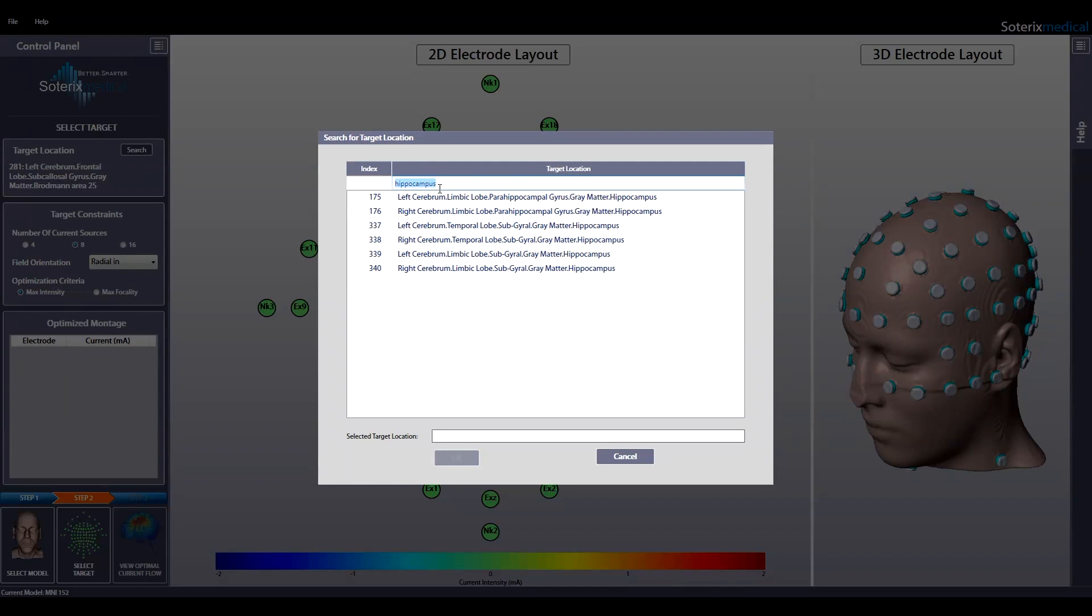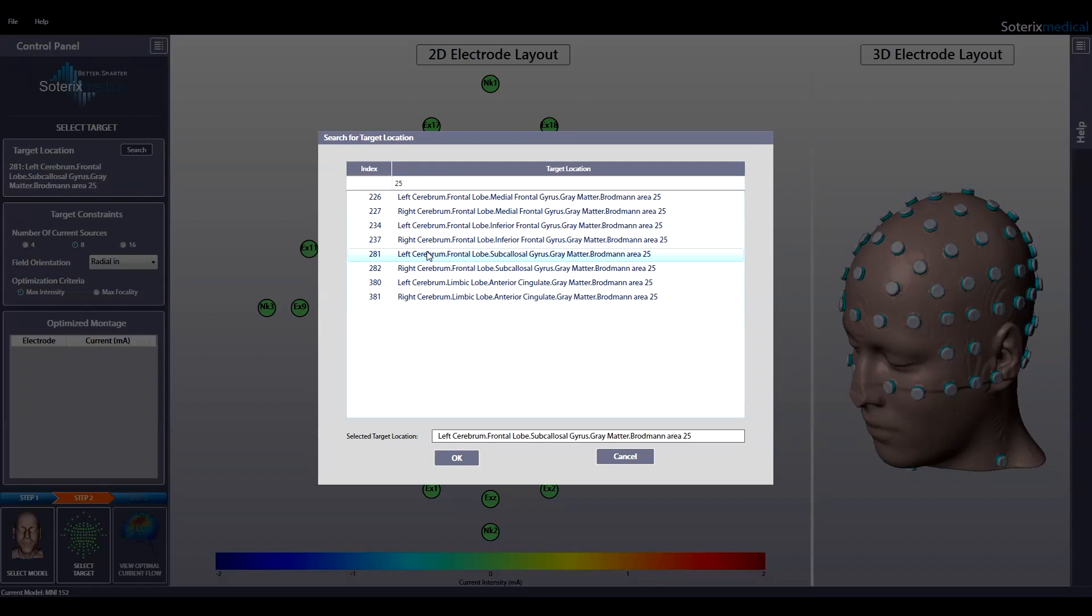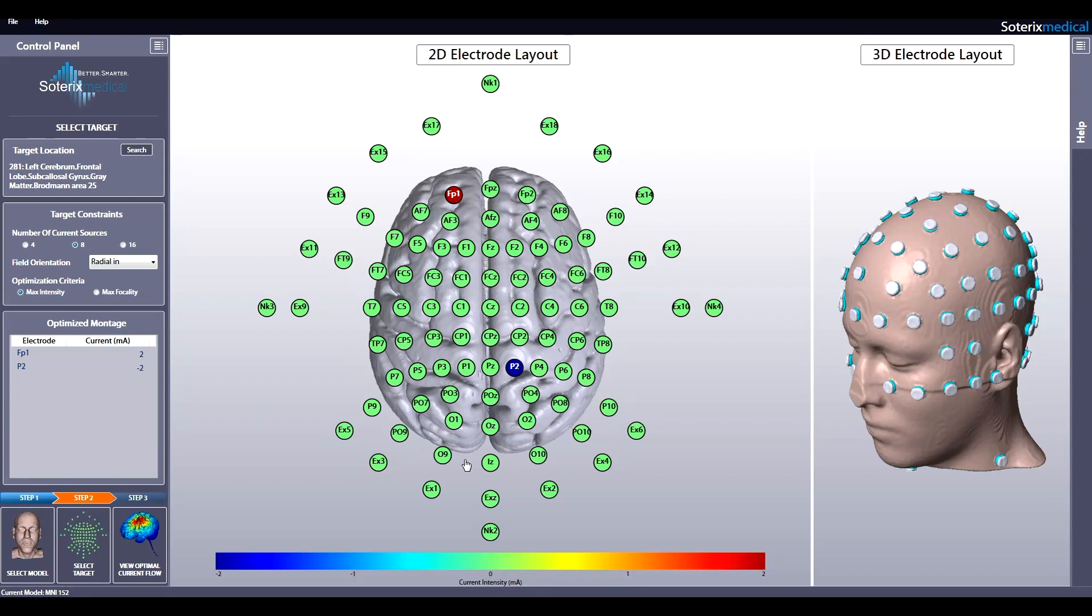Or you can search by Brodmann area, for example, 25. Select the region you are interested in and hit OK. Let's select region 281. Note that the target location selected is automatically entered in the target location box.